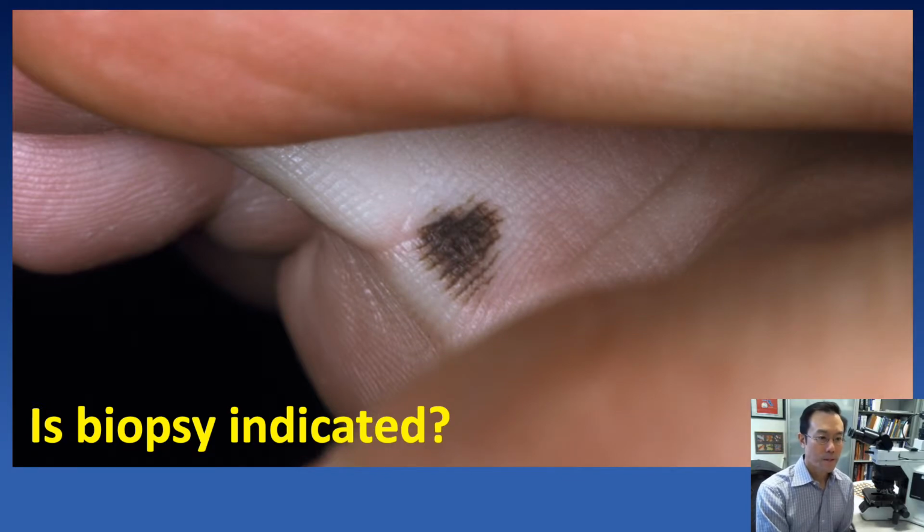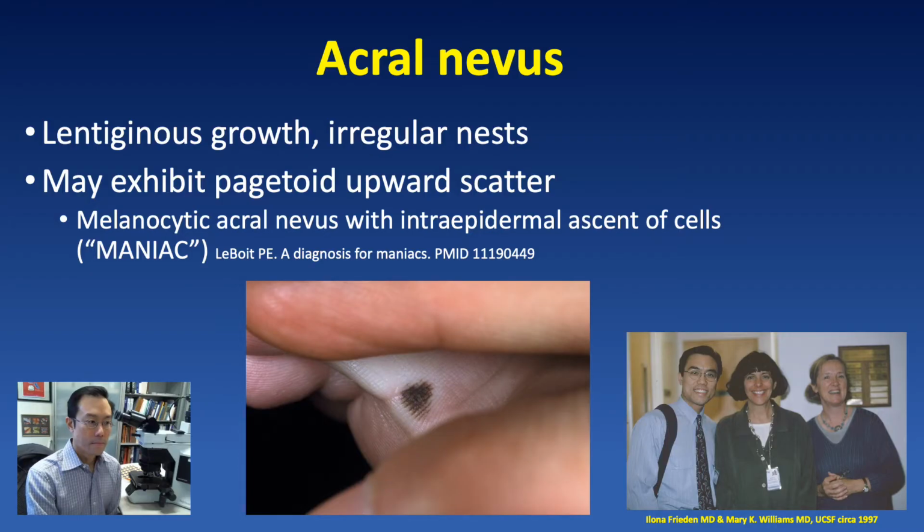Okay, transport yourself back to the dermatology clinic for a moment. This patient comes in. Would you biopsy this? Well, there's probably not an absolute right or wrong answer here. It might depend on some other clinical considerations. But what I can tell you is that this lesion was not biopsied.